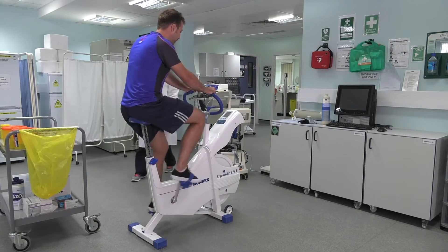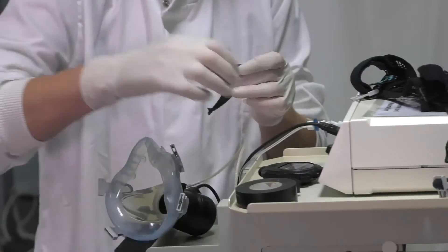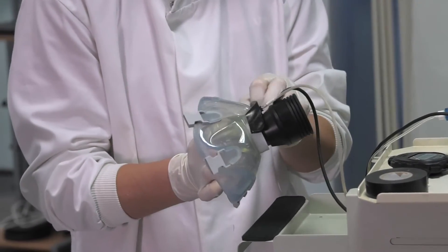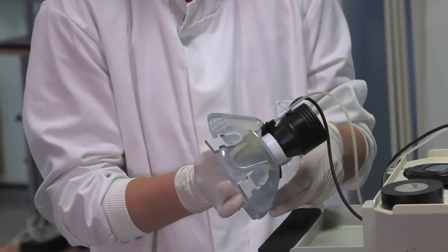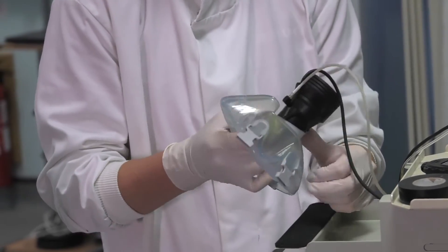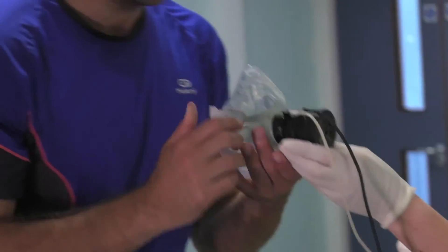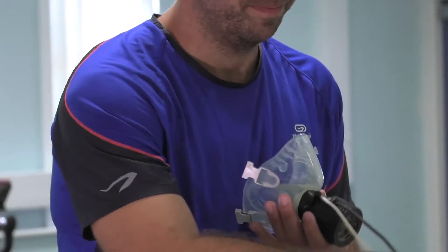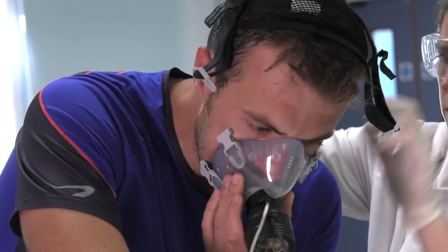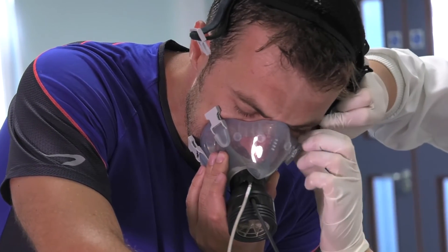You then go back and hopefully by now your warm-up is almost complete. Make sure you've found the mask that best fits your participant so that no air comes out when it's on. Connect the flow sensor and the gas sample line, and put a bit of tape to secure the flow sensor to ensure it doesn't fall out when they're cycling. It is then placed over the nose and mouth of the participant and you use the hairnet to fix it. Make sure that it's tight and no gas escapes.